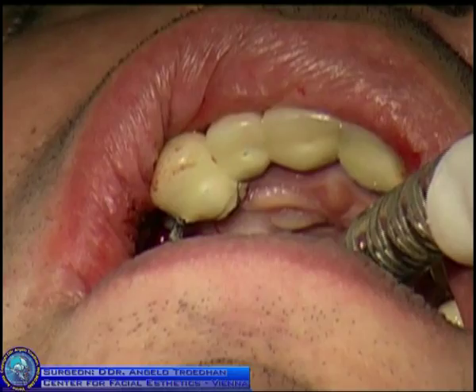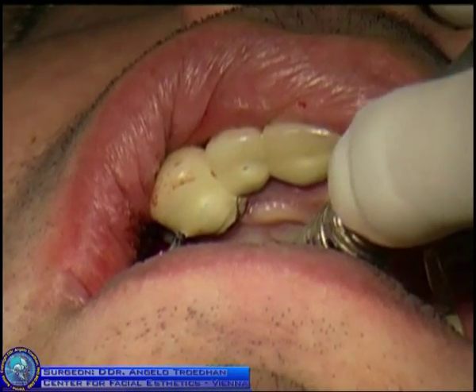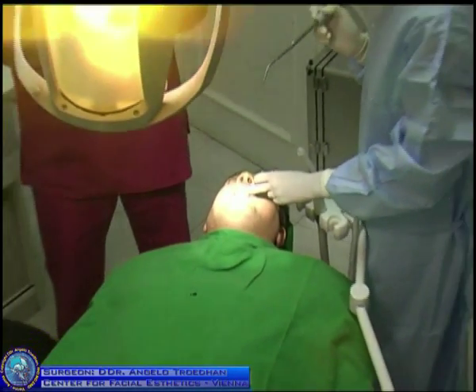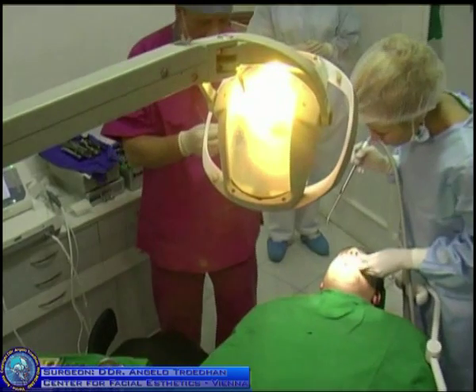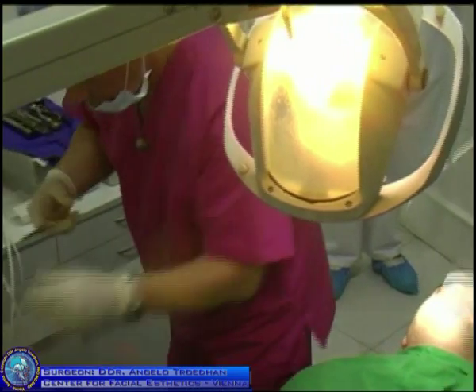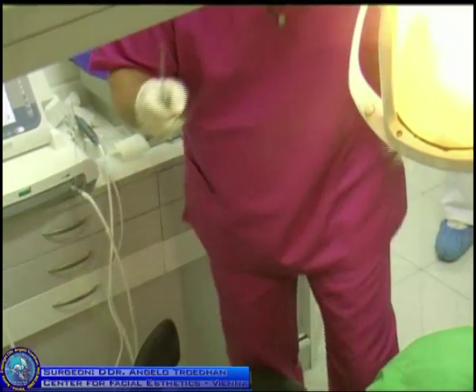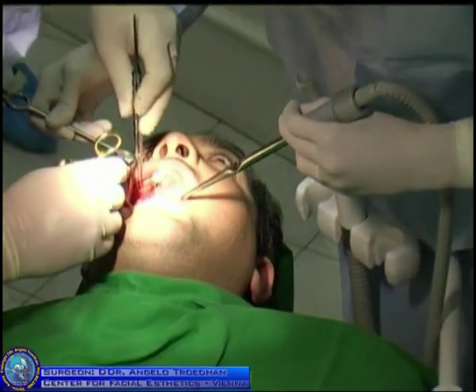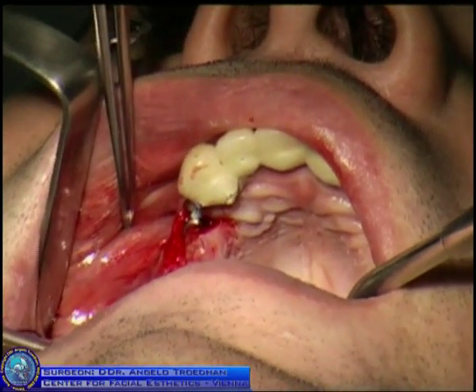Okay, and since we are finished now, we start the wound closure by suturing. What you take as suture is also only personal taste. Most of the time I take 5-0 or 6-0 resorbable sutures. But sometimes I take also 3-0, like we do right now. So the needle is a little bit big, but it will work. Hopefully.